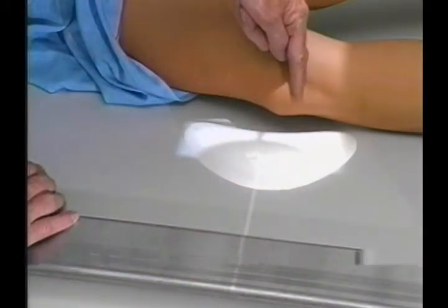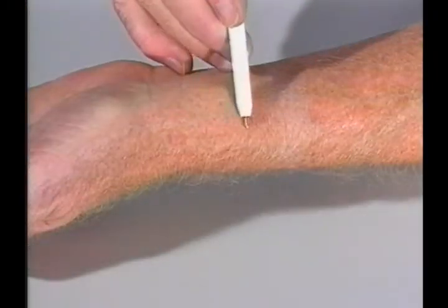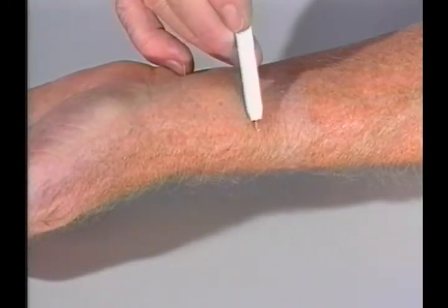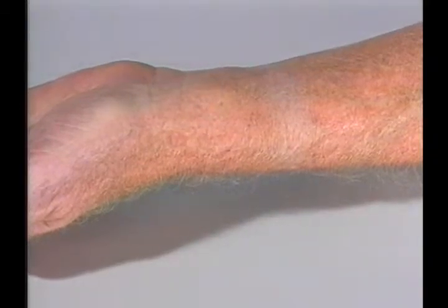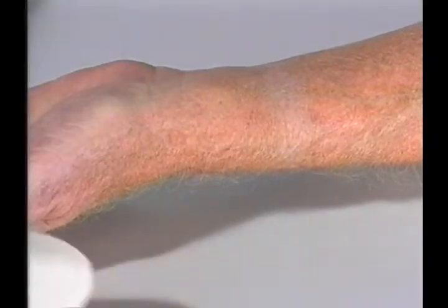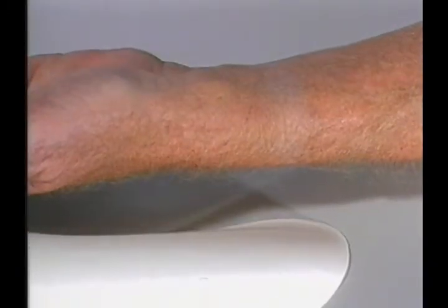In extension, however, it will be better to use the 5-degree boomerang or the little prism. A superficial lesion, especially with tomography, is often over-penetrated. It will greatly improve with the boomerang or the little prism, as seen here at left. On the right, there is no filter.